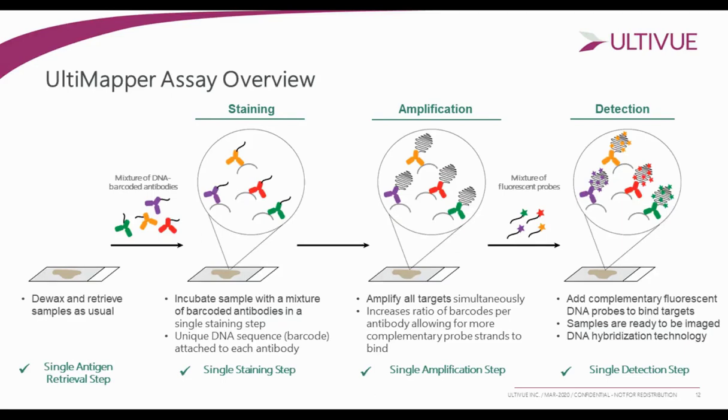This allows us to eliminate the need for any secondary antibody, which helps eliminate things like nonspecific and background staining. This also allows us to use any species of antibodies we see fit. They could be all mouse or rabbit monoclonals, it does not matter. Species is completely independent.